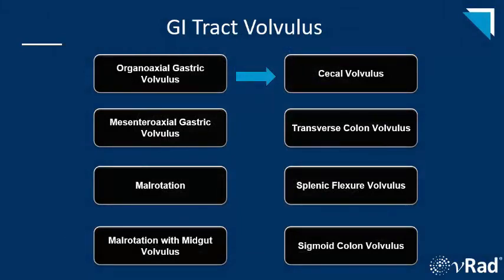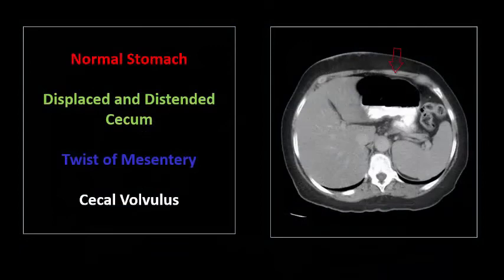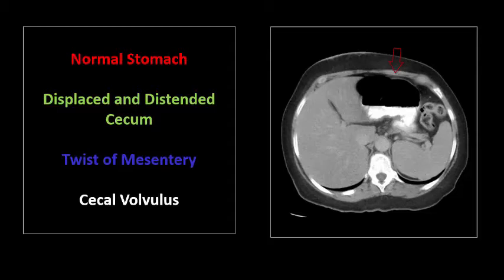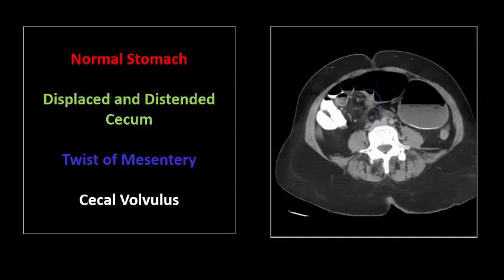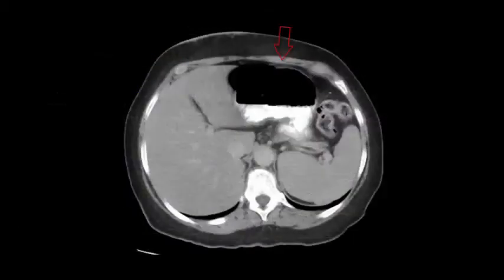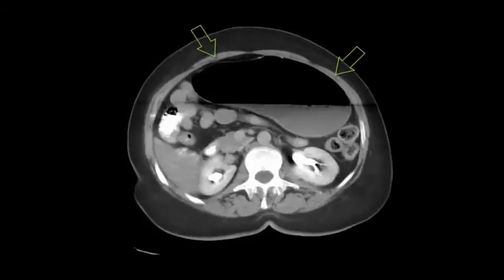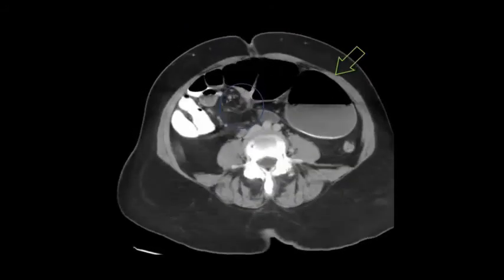Moving on to the large bowel. I point out the normal stomach, opacified with orally ingested contrast, to highlight how one might confuse the dilated and abnormally positioned cecum for a physiologically distended and normally positioned stomach. Adjacent to the stomach, we see the cecum displaced into the left upper quadrant, dilated with an air-fluid level. A little bit further down we see the characteristic twist in the right lower quadrant to confirm a cecal volvulus. Cecal volvulus accounts for 25 to 40 percent of colonic volvulus and there is usually a congenitally mobile cecum. Other predisposing factors include things that dilate the right colon, like pregnancy or recent colonoscopy.